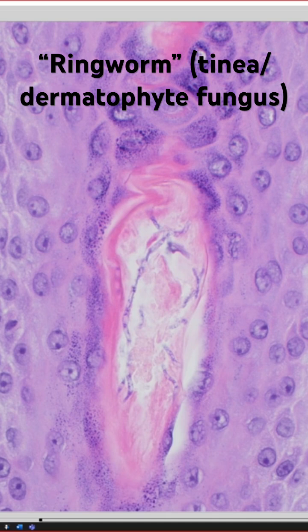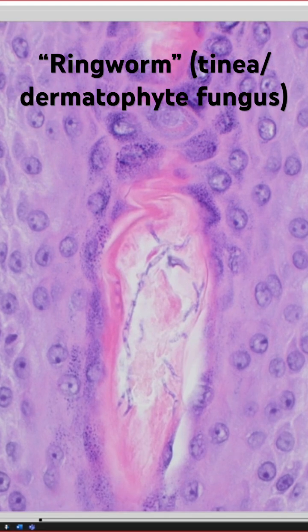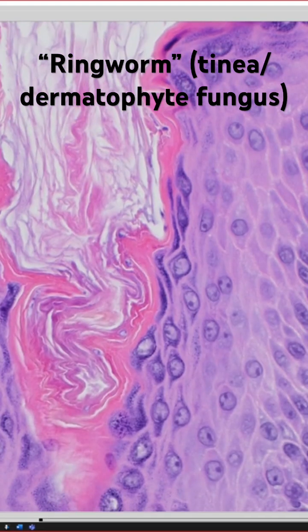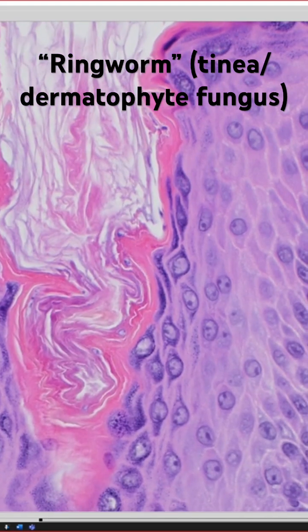But every once in a while — and I don't know why it is — every once in a while I'll see dermatophytes actually show up and be visible as a purplish-blue on H&E. But most of the time in my lab, at least in my experience, they usually are clear. But you can see them here.